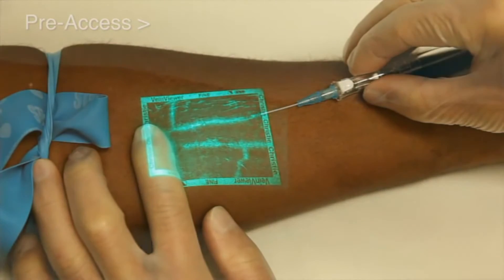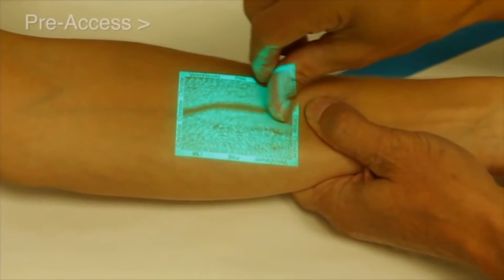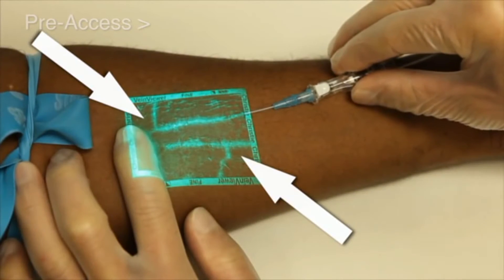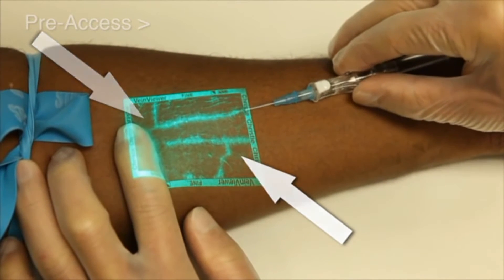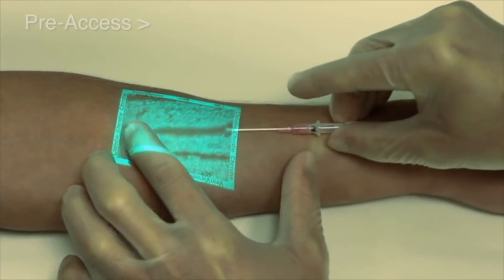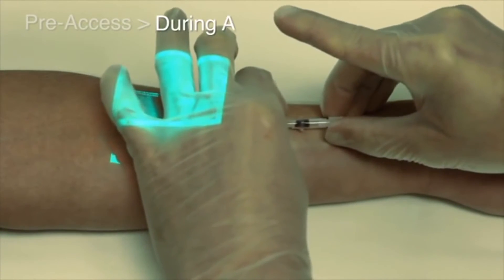The advantages of locating vessels up to 10mm deep and identifying clinical decision points such as valves, bifurcations, and the real-time refill rate of the vessel are key to your procedural needs in choosing the optimal access site.